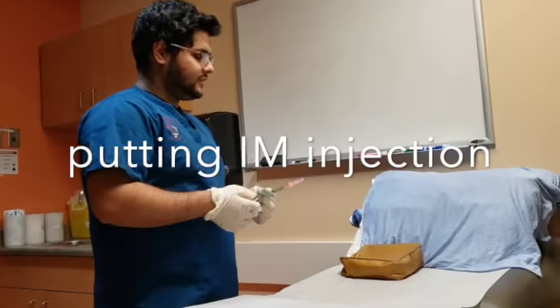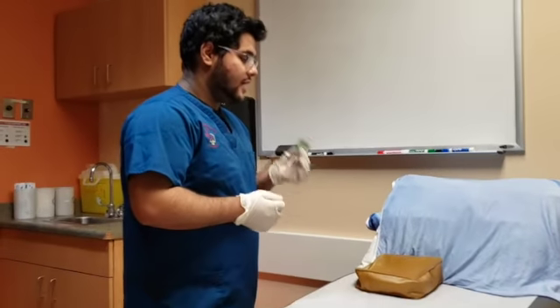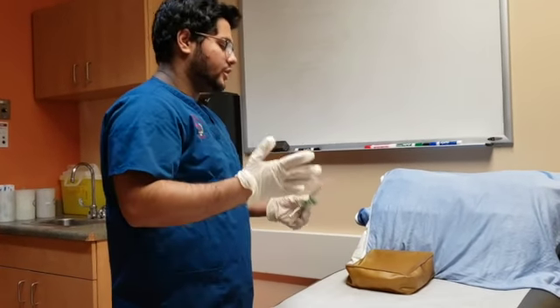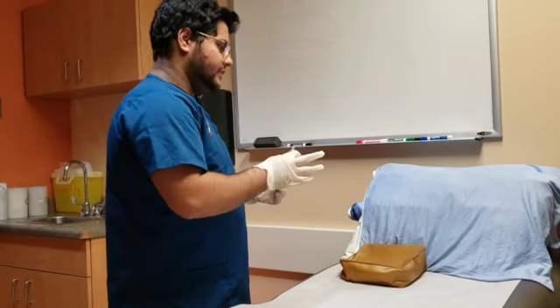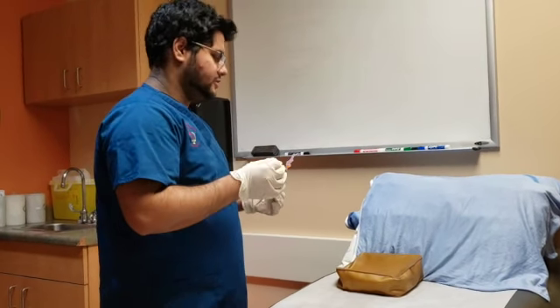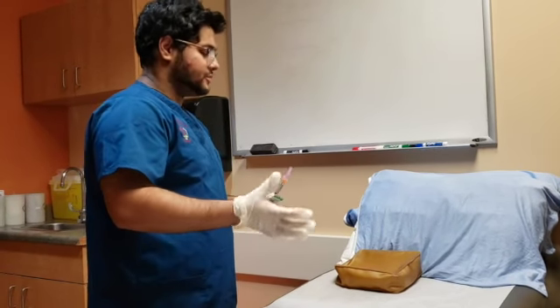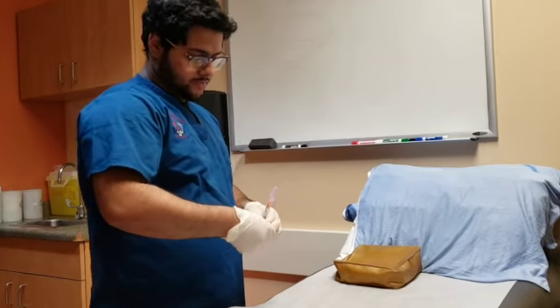Hello, Mr. Mancini. Now that I've prepared your medication, I'm just going to give you your intramuscular injection. This will be given in the deltoid muscle, which is in your upper arm. And the way it's going to work is I'm just going to clean the area, then I'll pinch it, and then I'm going to give you the needle. You might feel a little bit of a pinch because of the needle going in. If you feel any more discomfort, just let me know, and we can stop the procedure. Sound okay? Okay. So now, first I'm just going to clean the area with an alcohol swab.